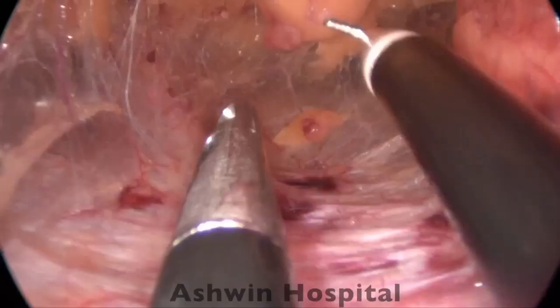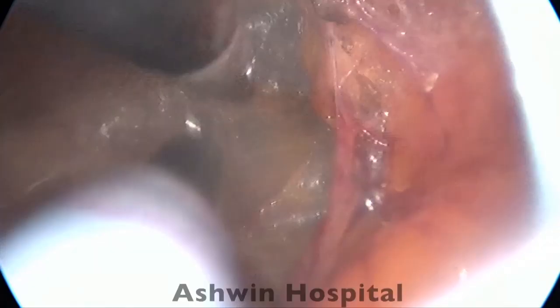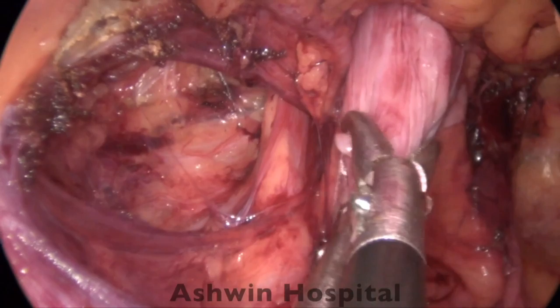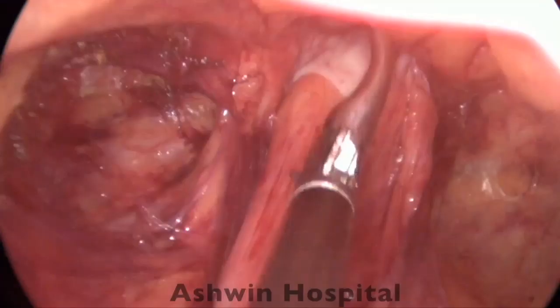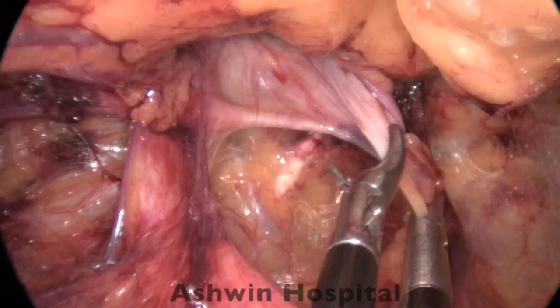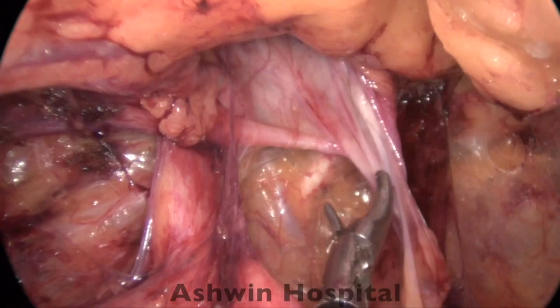TEP is a good area where we can do a SILS surgery. Here we have used the SILS platform because right from the beginning you have two instruments available for your dissection, which makes it easy for you to open the plane in a nice atraumatic blunt fashion. So this movement again is good enough. You reduce the hernia similar to how we would do it in a multi-port TEP repair. All the principles have to be adhered to. That is the most important. There is no point doing an inadequate dissection and saying I did a hernia repair in TEP in a single incision manner.